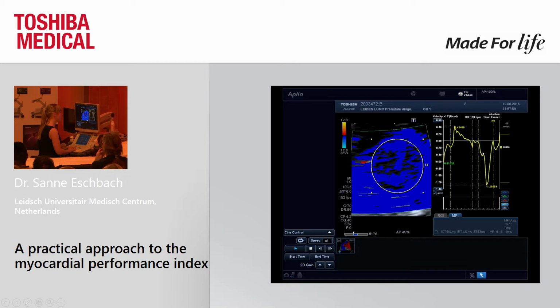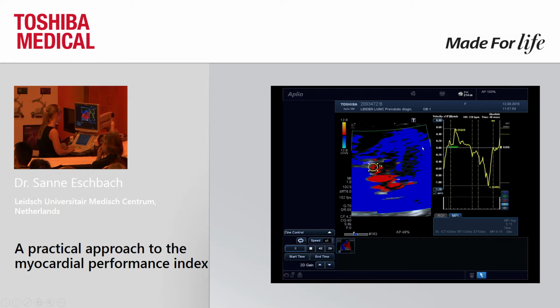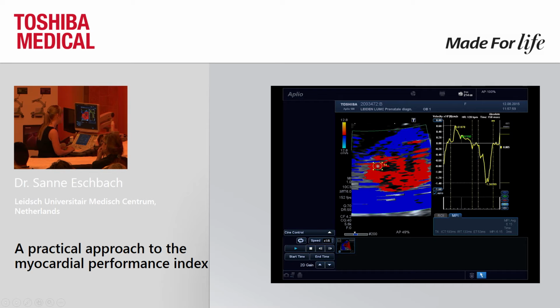And in this fetus, you can see that the relaxation time is shorter than the contraction time, which we found more often in these recipient twins in TTTS. And we can try as well to find a smaller region. Let's see if we found the right spot. Just above the AV valve, you can lower the speed if you like to see it more clearly.